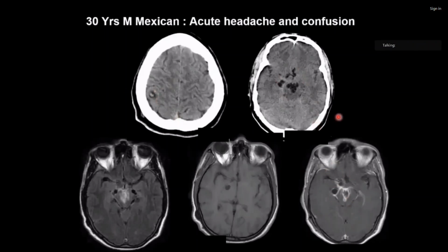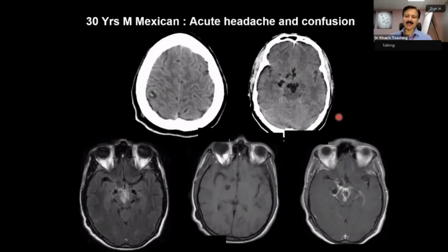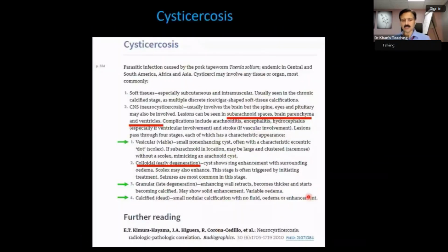The first one is a colloid. I'm not entirely sure, sorry. Okay, good. At least you remember the word, so I like that. And this is the colloid. So let me come back to this.